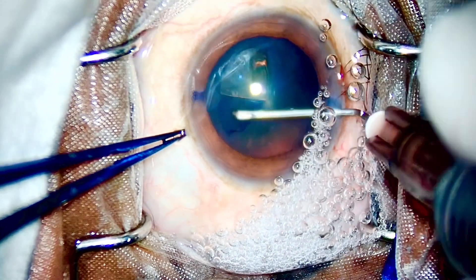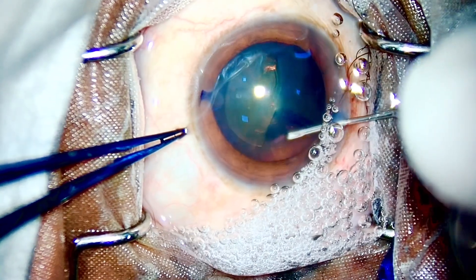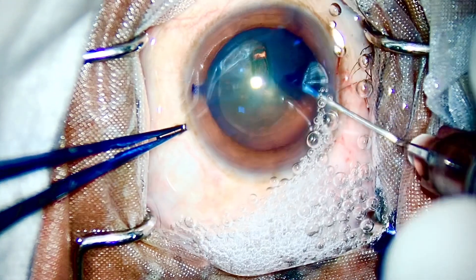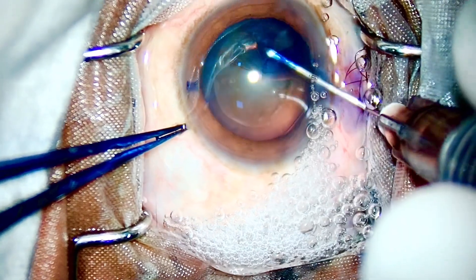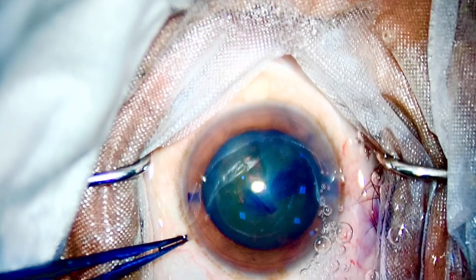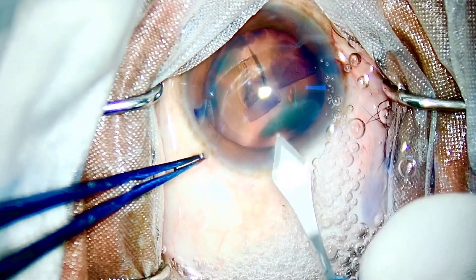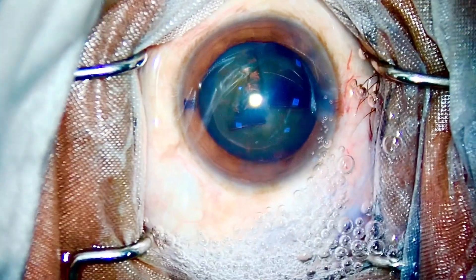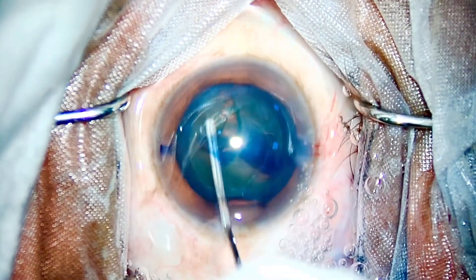Now we will show you the actual surgical technique inside the anterior chamber. Here comes a diabetic patient — I already know it's not going to be an easy case because diabetic cataracts are very sticky. They are one of the hardest cases to master for a new surgeon; the rates of PCR in divide and conquer are high. Direct chop fails because the consistency of the nucleus is rubbery and soft — you won't be able to chop this nucleus. You can do flip and chop, but the carousel technique is one of the fastest.